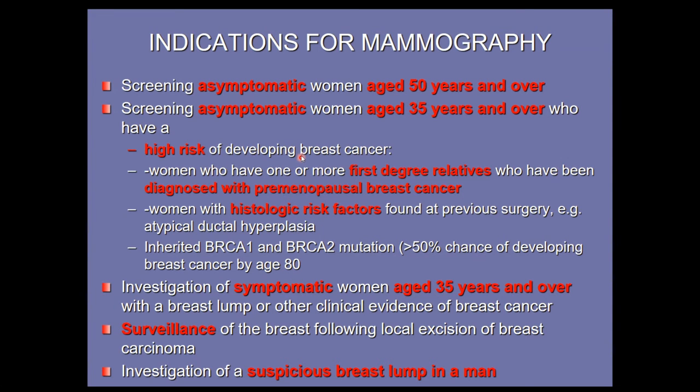So basically, these are for screening purpose. Whenever we are performing mammogram in asymptomatic women, we have to perform screening in every woman who is above 50 years and all the women who have high risk of developing breast cancer. We will start performing the mammogram at least once a year after 35 years.